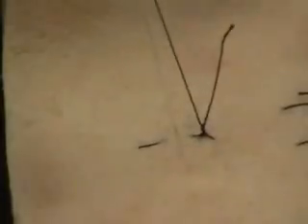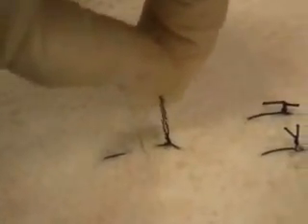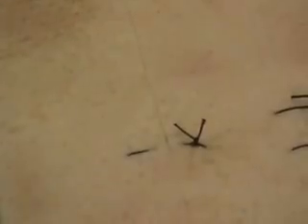And on this one we don't have to adjust it where we pull it over, it's just going to stay right there. Get ready for our cutting technique. And this is how it will look on the top. You're going to see sort of a linear line here and then this other linear line, and you'll have that all the way along. Now, what if we had to take these sutures out?